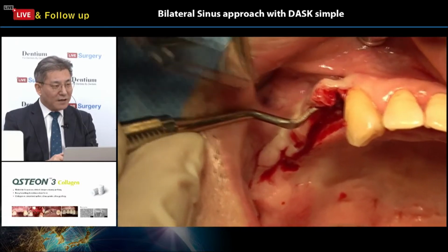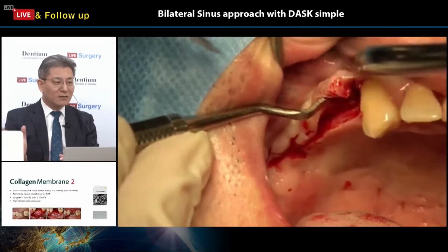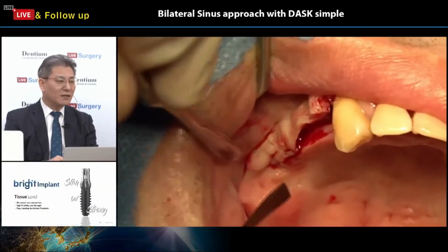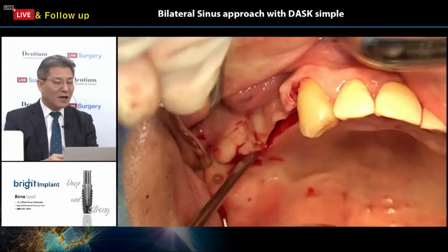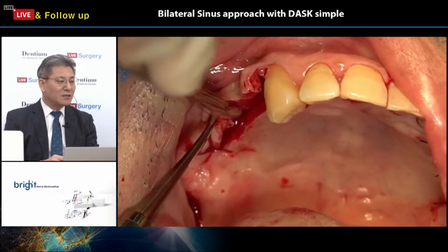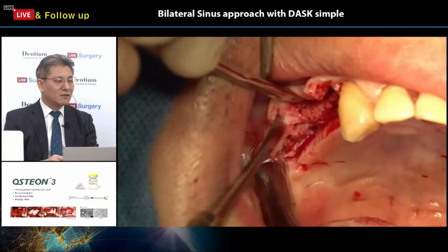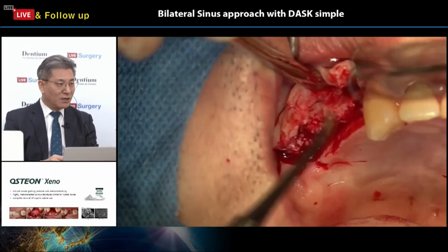It seems like the ridge width is wider than the opposite side. I think the number 14 area is much better than the number 24 side. So I think a little bit wider diameter and longer implant, without the GBR procedure, makes it easy and makes it better due to the remnant of the ridge. Okay.